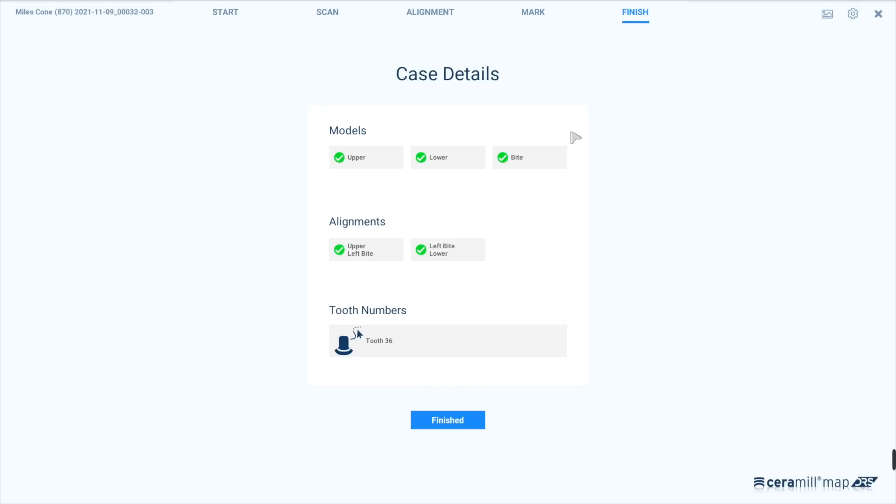Afterwards you will see an overview of all of the scans and the alignments. Click on finish and this will get you back to AG Live.